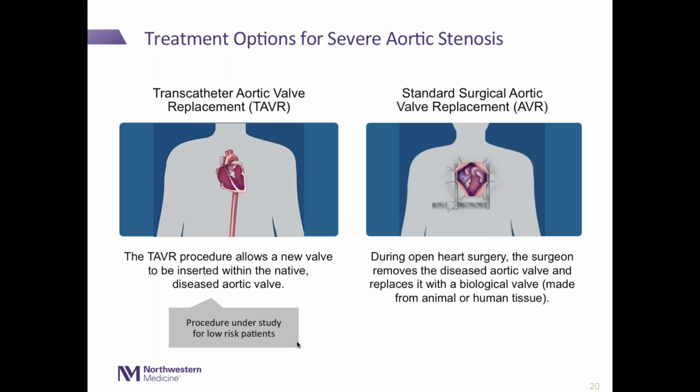Now, patients that are candidates for this trial will get one of 2 therapies. The first is standard aortic valve replacement, seen to the right here. The other will be the transcatheter valve replacement, or TAVR. This procedure is under study for low-risk patients.